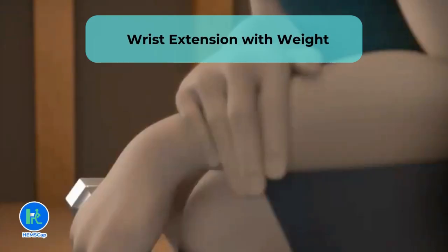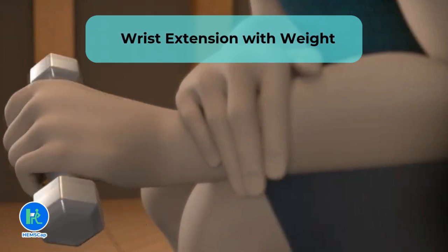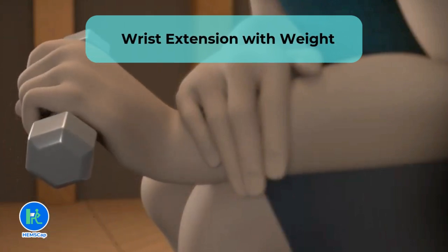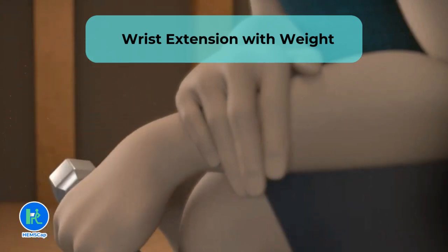By performing wrist extension with weight 3 times, the patient strengthens the wrist extensor muscles, allowing assessment of wrist function and progress. Since this movement overlaps with assessments, it is used in the platform both as an exercise and as an assessment.